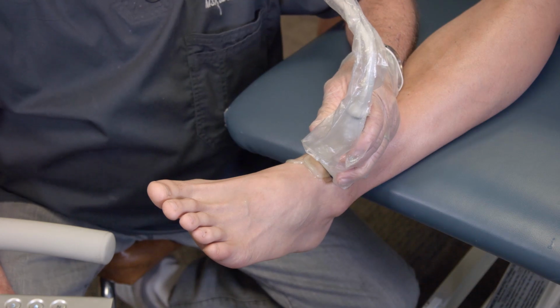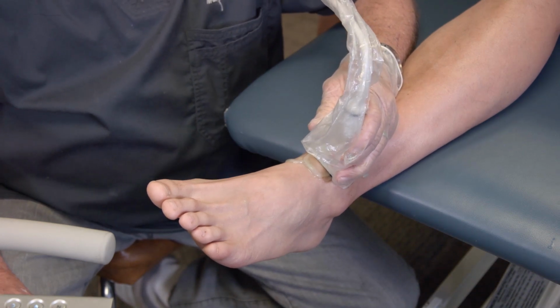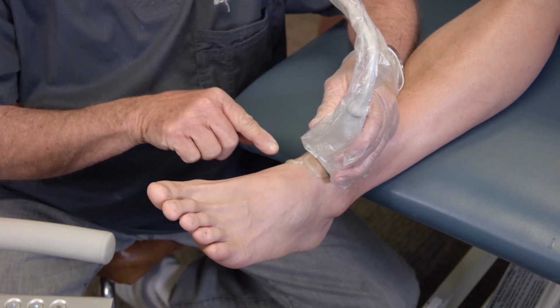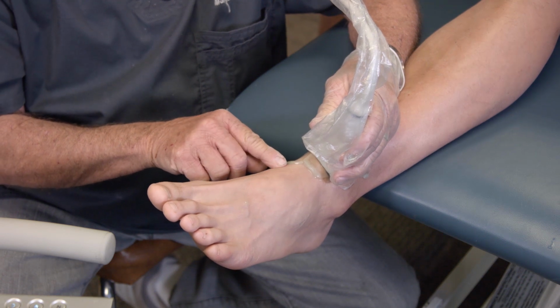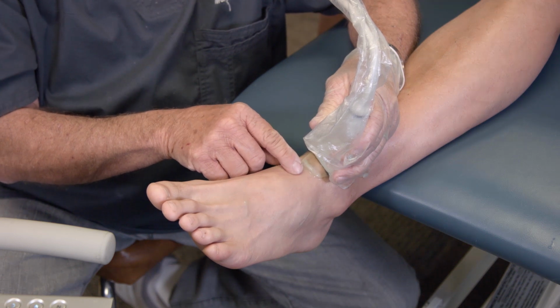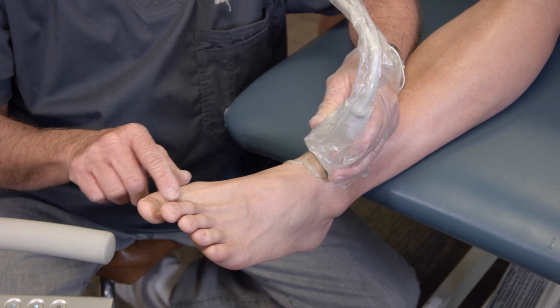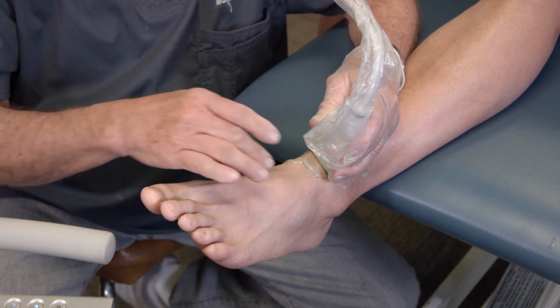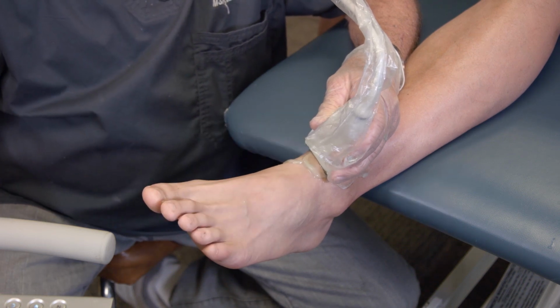We begin at the anterior ankle in the short axis. If we look at the tendon structures on the foot, we see the anterior tib is more medial and it inserts on the cuneiform. Then we have the extensor hallucis longus tendon that attaches to the dorsal part of the big toe. Then we have the digitorums that attach to the rest of the digits.